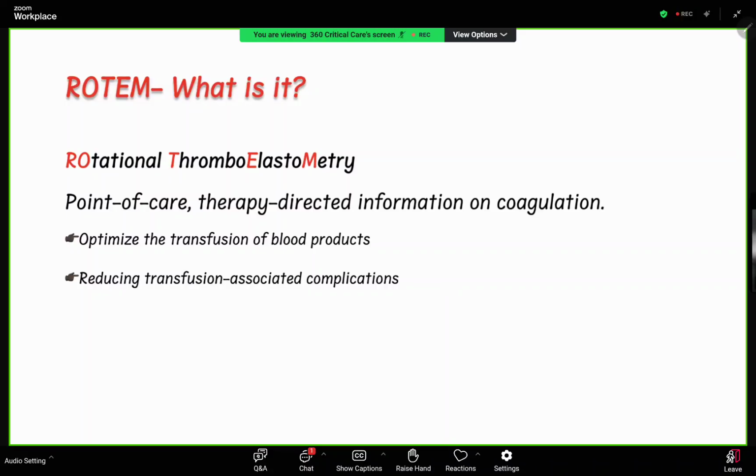Okay. Good evening, everyone. So, as the first was saying, this is a very important topic, and exactly a bit confusing also. So, in the example, they will be giving you a picture of a Rotem, and they will be asking you about your interpretation or your management plan.